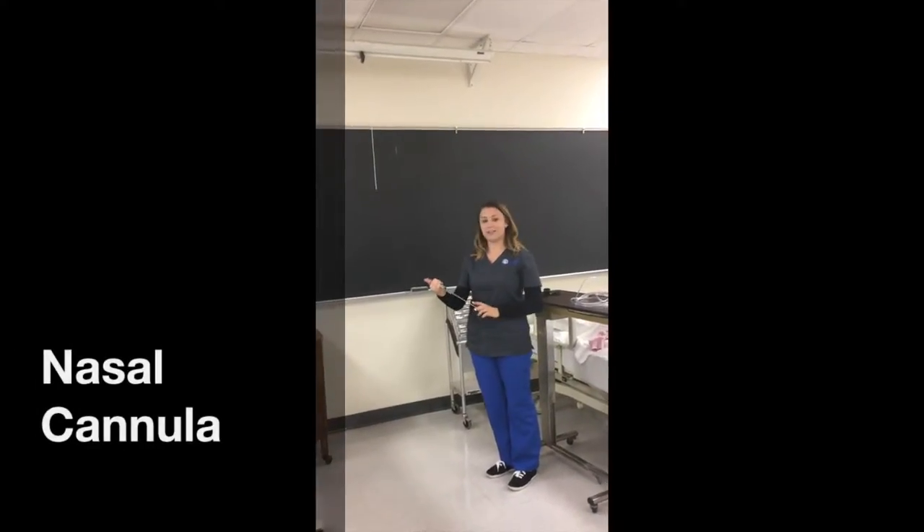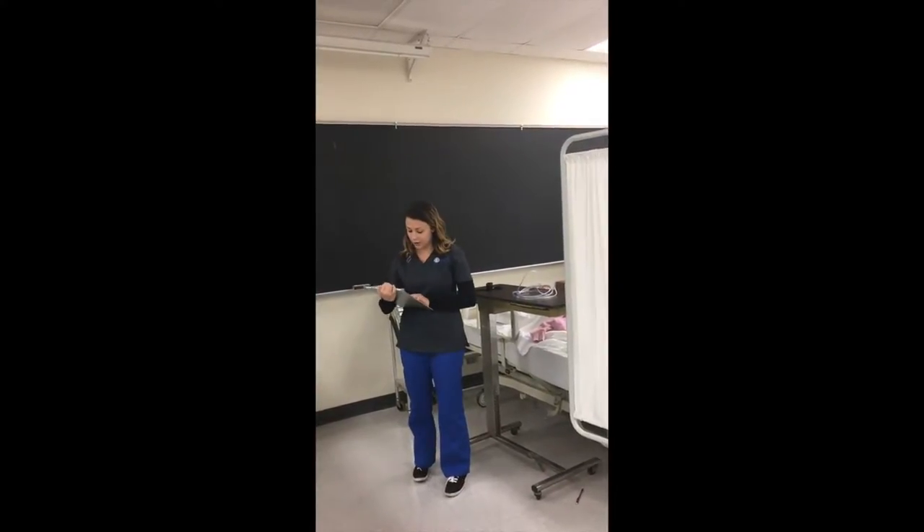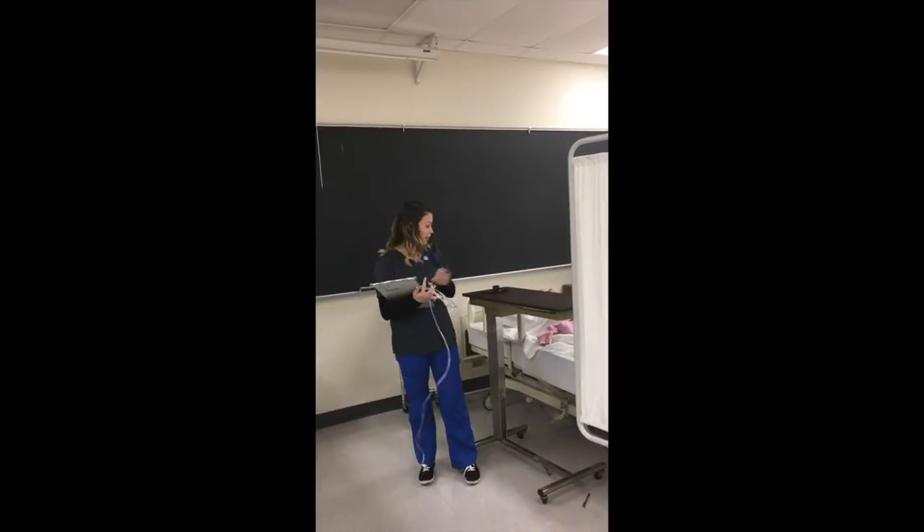I'm going to verify my doctor's orders that this patient needs two liters on a nasal cannula, which is approximately 28% FiO2. I'm going to review the chart. Her SpO2 was 90, which is just a little low. So I'm going to gather my nasal cannula and my pulse oximeter.